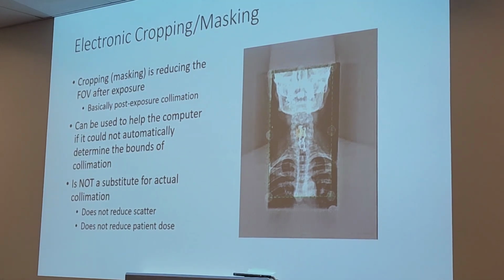For example, windowing and leveling. You shoot a picture, it's got a certain window level, it's got a certain window width. You change it before sending it to the radiologist. Guess what? The image saved in the system is the new data that you changed it to. The old information is permanently gone. It has been lost forever. And it's possible that you have decreased the quality of the image, and now they can't ever put it back to the way it originally was. So you need to be very, very careful with what you do in terms of post-processing.